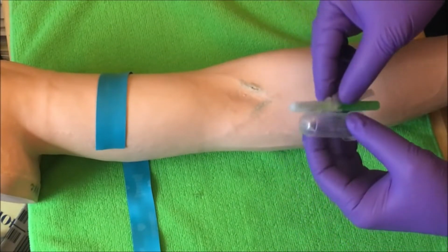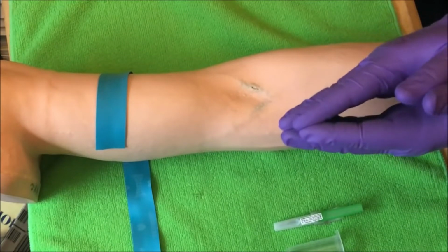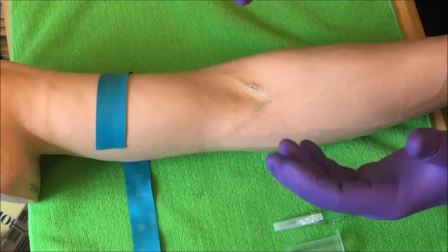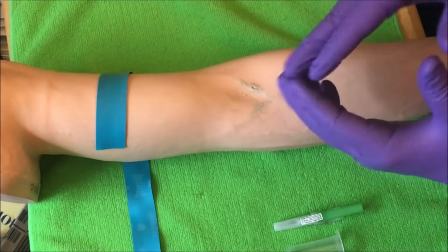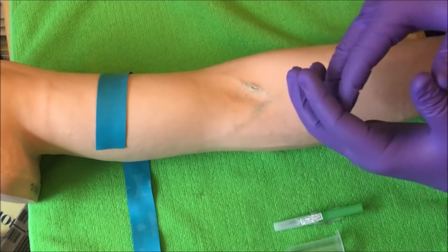Now, I'm going to talk about this in a minute because I want to make something clear. When I go into a patient's room and after I do the patient ID and I make sure that the patient is who he is, and if you go back to my lecture videos, I talk about the steps, the 3 P's of asking a patient, which is important. So if you're not familiar with that, please go back and watch that.